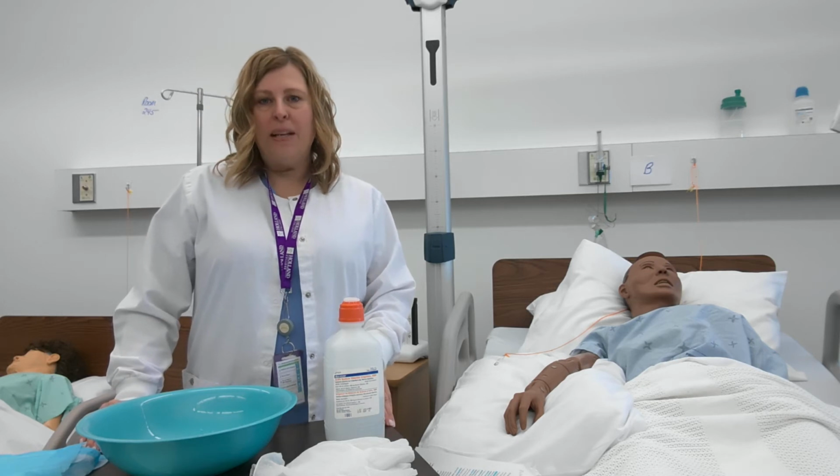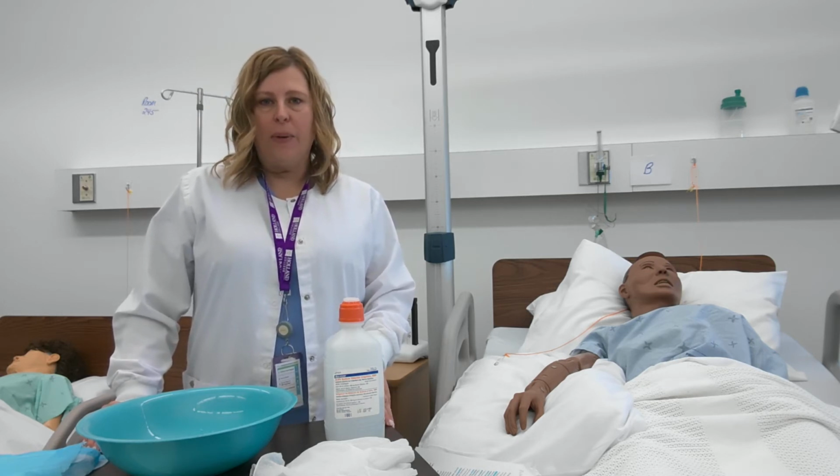Hi everyone. The demonstration today I'll be doing is moist heat therapy.